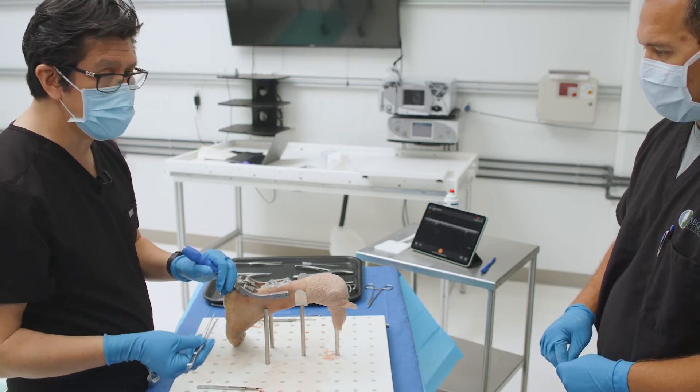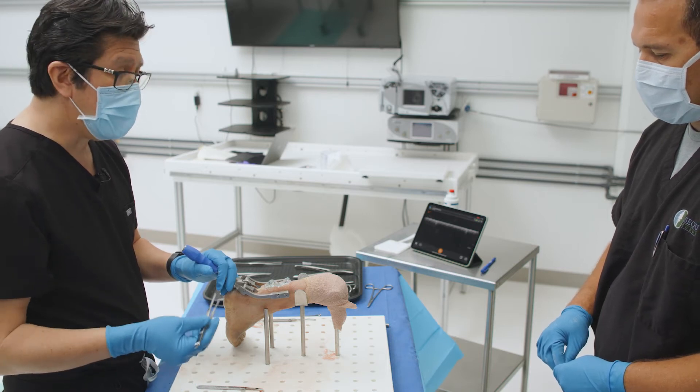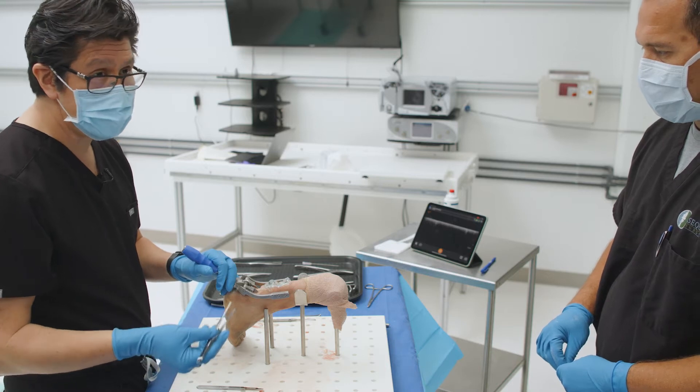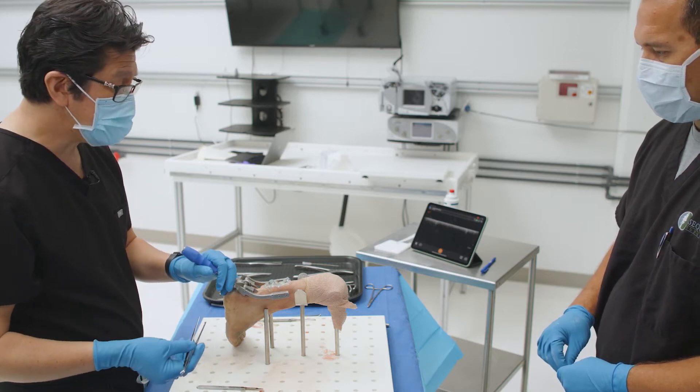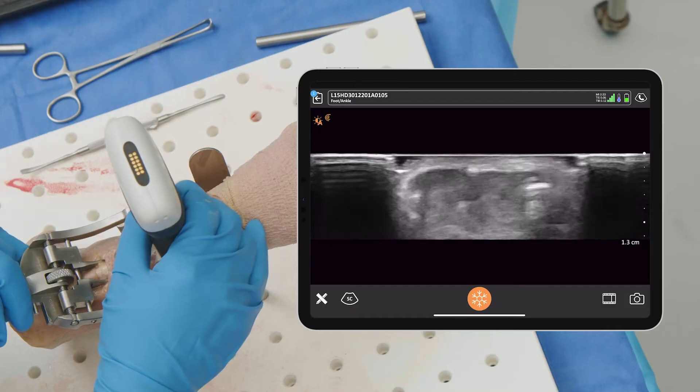If done without ultrasound, you might actually pass the wire and the suture needles unfortunately superficial or deep to the tendon, or just at the edge of the tendon. So you really do need ultrasound with this technique to make sure you verify you're in the proper spot.